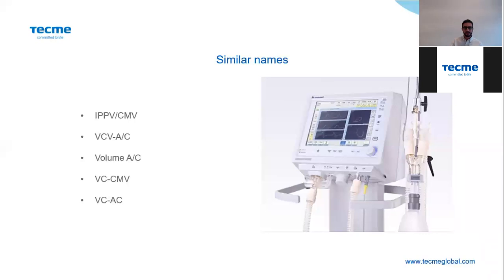Well, now I have some questions about VCV. I will start the questions, please answer them. The first one is, if the patient's airway resistance increases, what will happen with the inspiratory pressure? And the second one is about the alarms. What do you consider to be the most important to program in VCV mode?